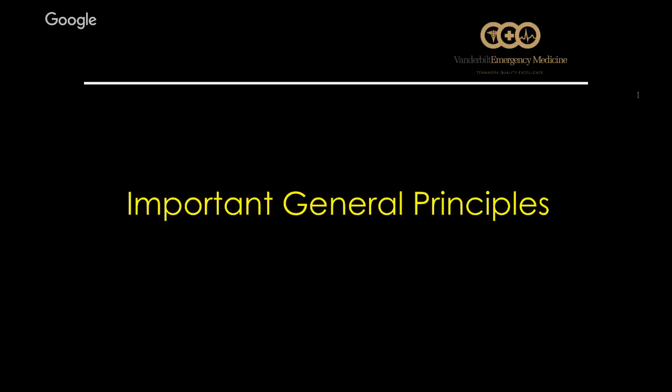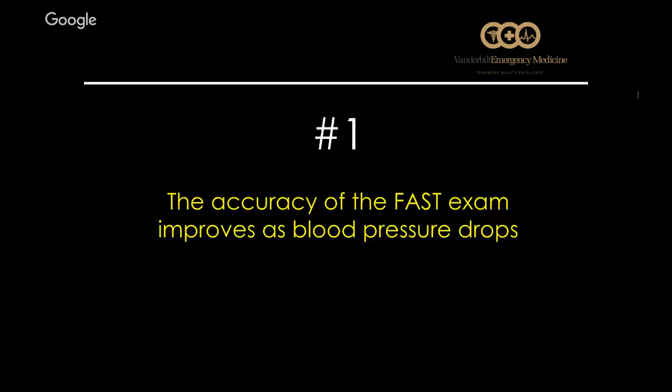Here's a couple important general principles that we need to keep in mind as we're talking about the FAST exam. Next slide. So the more blood that a patient loses in their chest, around their heart, or in their belly, the more sensitive the FAST exam is to find it.